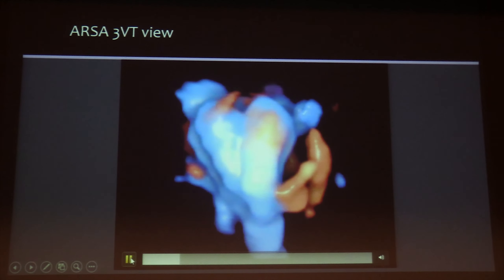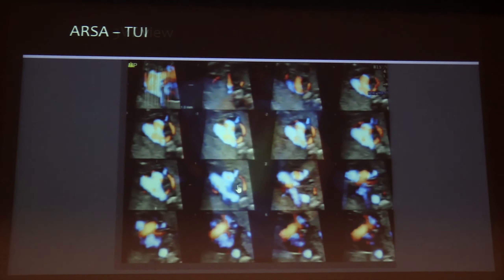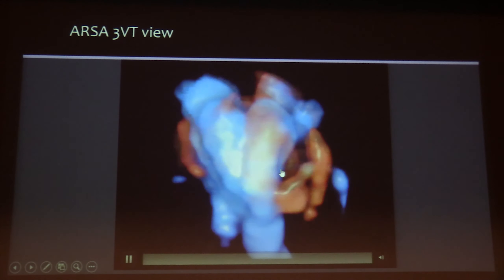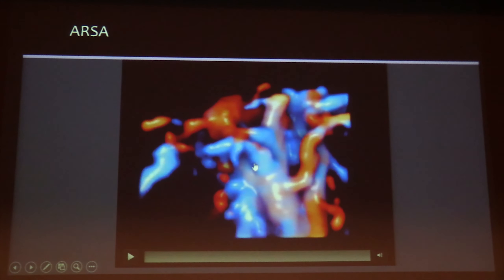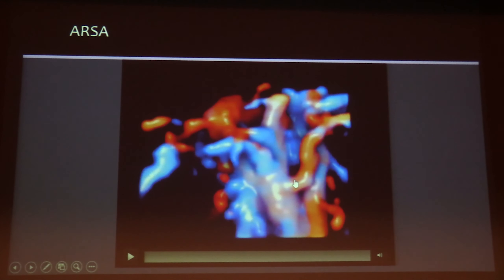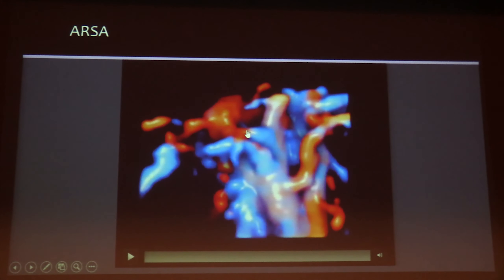Another dimension can be added for the diagnosis of aberrant right subclavian artery. This was a quite difficult case where you can see the aberrant vessel coming from the aorta, in a case of interruption with azygos continuation. This is really an advantage in complex cases — you can see one bifurcation, another bifurcation of the aorta, and the aberrant vessel. The sensitivity and specificity of this modality makes it a real advantage for diagnosing difficult cases.